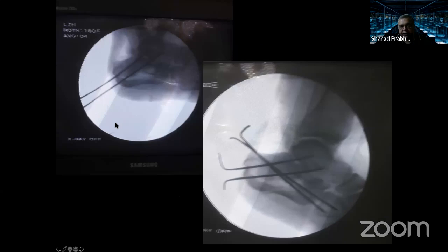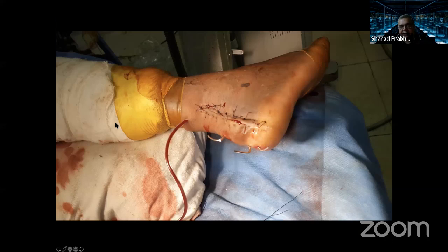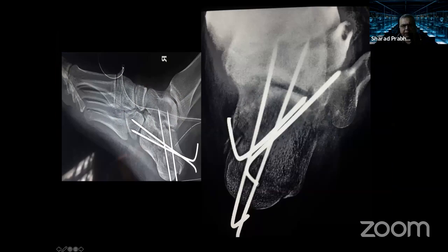You get a void. On your C-arm, there's your bone hook over there, and you temporarily fix it with the K-wire. These are one of the earlier cases we fixed with wires, with a single incision. We do put a drain later, and that's the post-op X-ray.